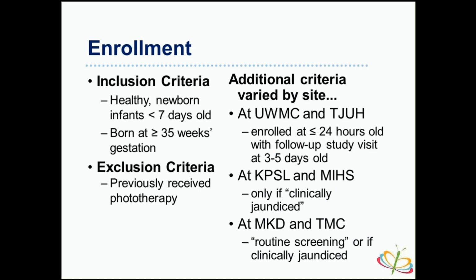At 2 institutions, data was only collected if they were, quote, clinically jaundiced. In 2 other institutions, they did both a, quote, routine screening on newborns in their nurseries, or if they were clinically jaundiced.